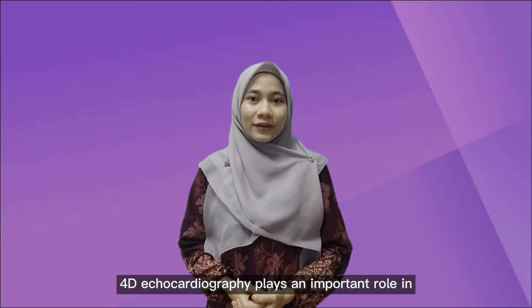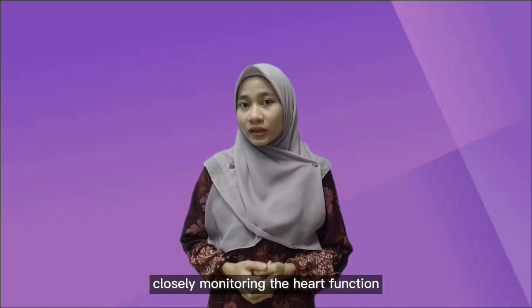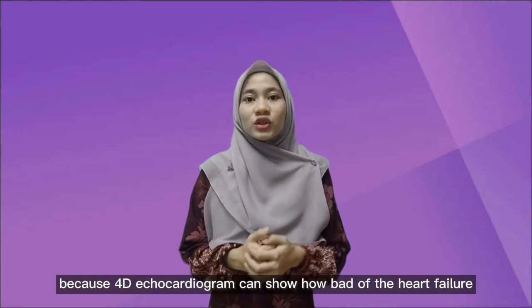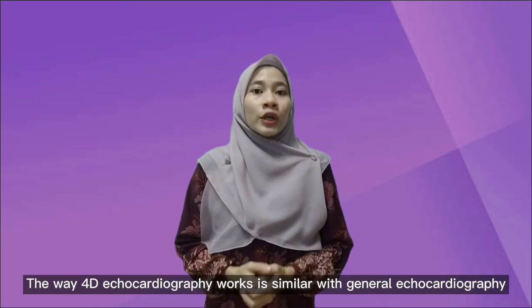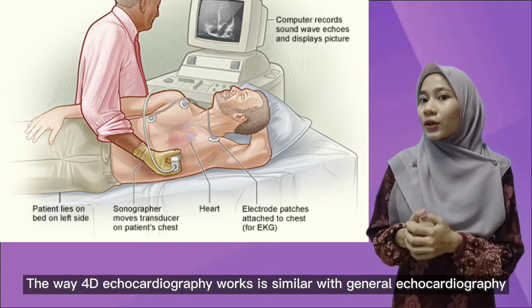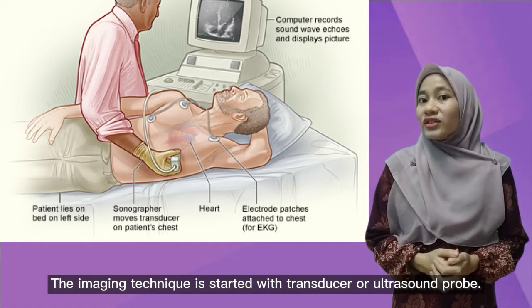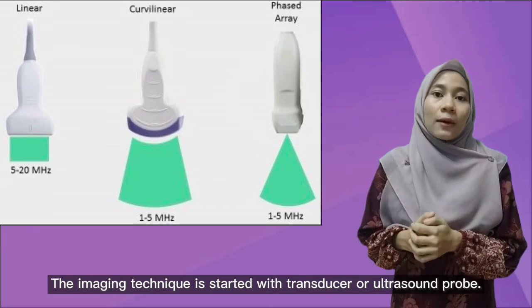Echocardiography plays an important role in closely monitoring heart function, especially helpful for patients with a pacemaker implant, because a 4D echocardiogram can show how bad the heart failure is and the type of heart failure. The way 4D echocardiography works is similar to general echocardiography, and they work along with the electrocardiography or ECG. The imaging technique starts from a transducer or ultrasound probe.